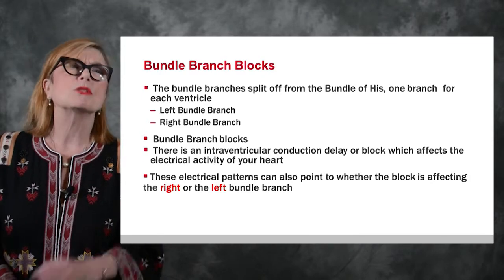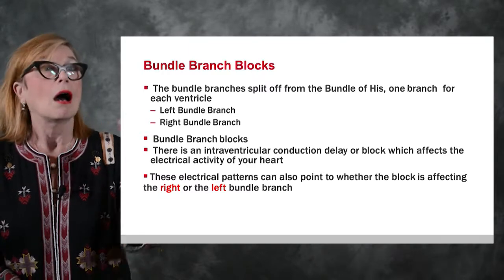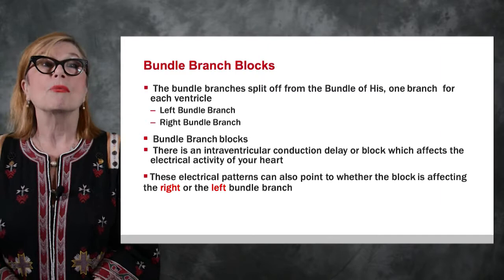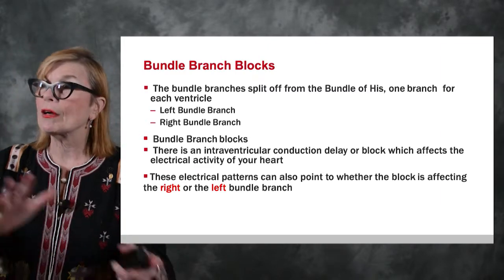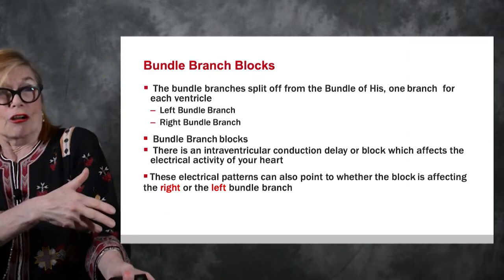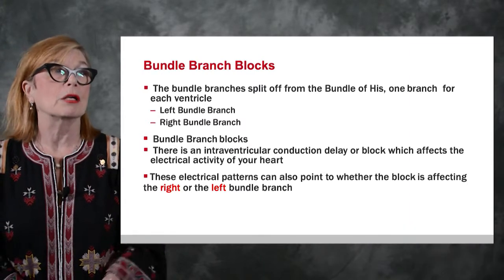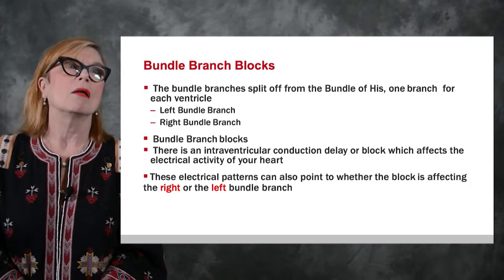Now that's what happens with a complete bundle branch block, which is our focus for this class, a complete bundle branch block, not an incomplete. Okay, so those electrical patterns point to the side. If current is going to the left, to the left side, that is the normal direction of current because the left ventricle is a large ventricle. But it takes more time than usual.